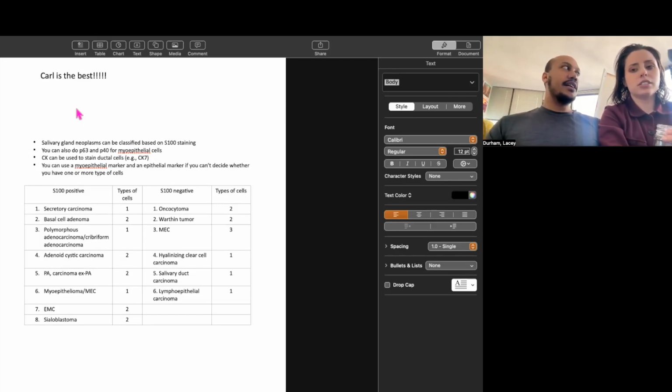to favor oncocytoma. Can't rule out Warthin's tumor because it's only a small representation of the rest of it. Can't rule out, even though this microscopic specimen doesn't look like oncocytic carcinoma, that it's not oncocytic carcinoma elsewhere in the lesion. So that's how that was signed out.